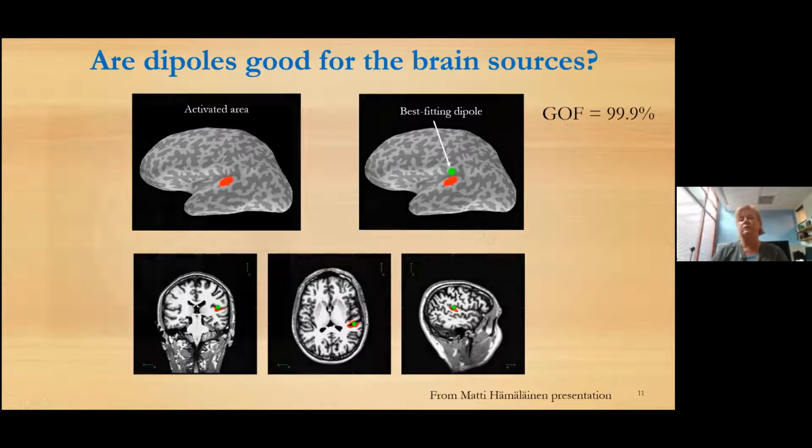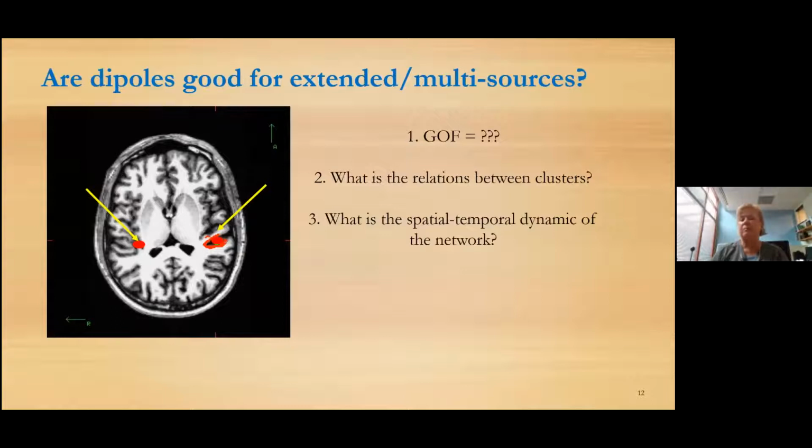But what happens if we have not a single source? Mostly MEG patients are more difficult patients in terms of their signal. That's why they send those more complicated patients for the MEG study, where they can see bilateral sources, where EEG can see generalized activity, where EEG just sees activity which comes from both hemispheres at the same time, or multi-source. So those puzzling, most difficult, complicated patients usually go to the MEG exam. We should find out how exactly, and with what accuracy, we should perform the analysis of their data and give results to the surgeon, to plan surgery or do implantation. Those questions are really hard to answer, especially if we deal with spontaneous data.